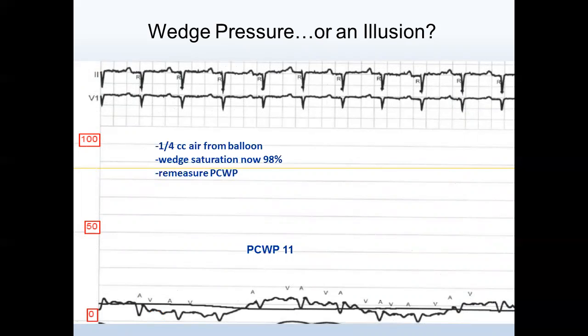You pull it back in, drop it down to a quarter balloon, and then slowly advance forward, or you just drop it in place and let the blood get it out into the periphery? Perfect. So over time, from different people, the technique I learned is, you go with the balloon. Push. You're wedged now. And then you get this tracing, you're not happy. What you do is keep pushing slowly, gently, till you form a slack in your Swan-Ganz catheter.